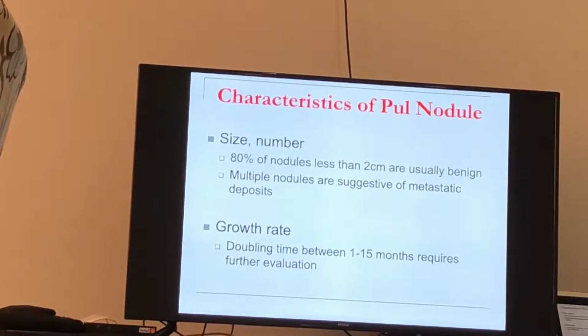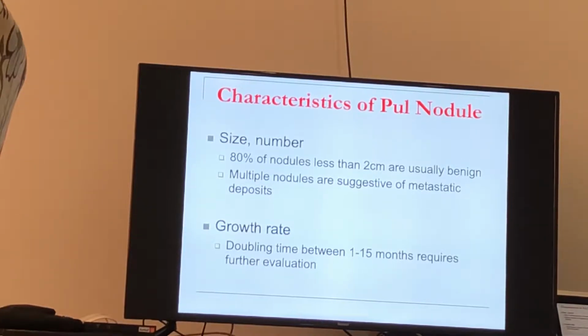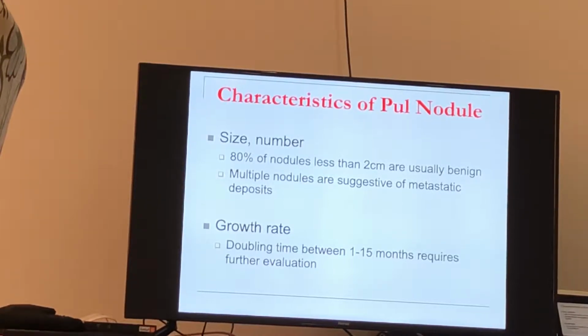Fine. When you characterize a pulmonary nodule, you have to comment. There are things that you have to say. Like if you're calling me: there is a patient that has a nodule in the left lower radiological lung zone. It's subpleural, it's rounded, with a well-defined border, it's about 2 centimeters in size in the maximum diameter, all these issues.